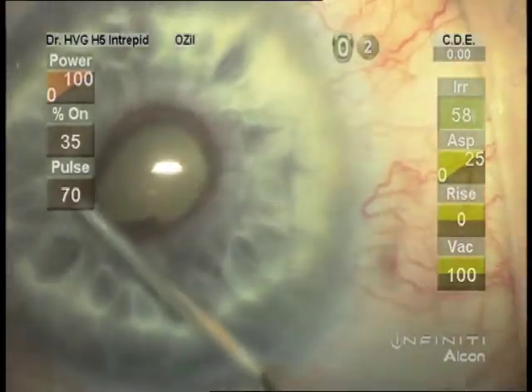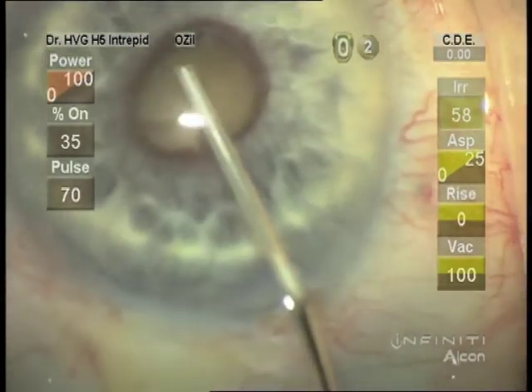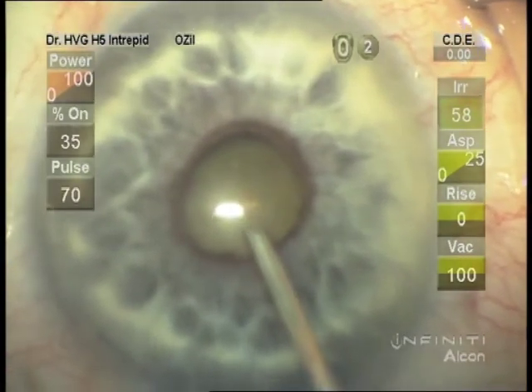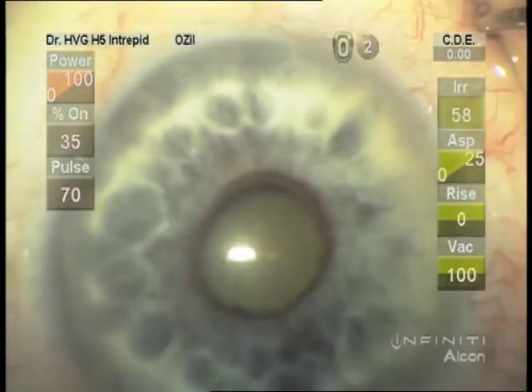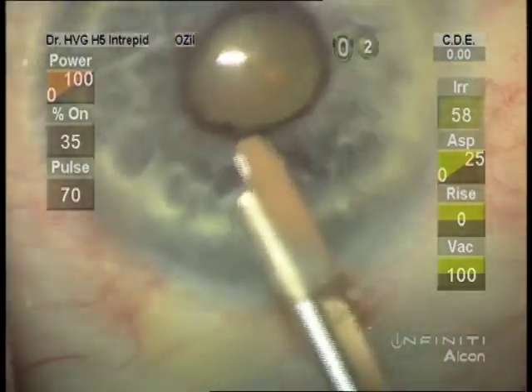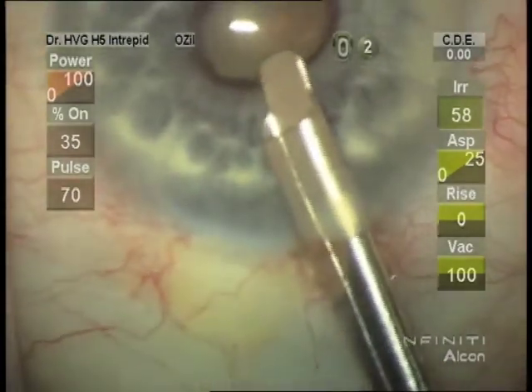To make it easier to engage the pupil border with the Malugan ring, stripping more viscoelastic from the angle of the incision entry. And now the placement of the Malugan ring.